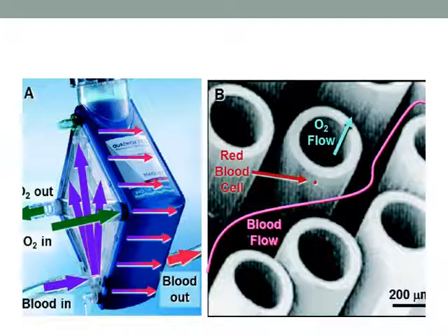The first oxygenators were leaky. At the end of just a few hours, there was liquid just dripping out of the oxygenators, and then they basically all plugged up and didn't work anymore. These don't do that unless something's broken. Unless one of these fibers breaks and blood gets in, we don't get blood out of it, we don't get liquid out of it, we don't get albumin out of it. It will slowly get little clots on it and get to the point it doesn't exchange gas well. But it can last many days and sometimes even weeks.